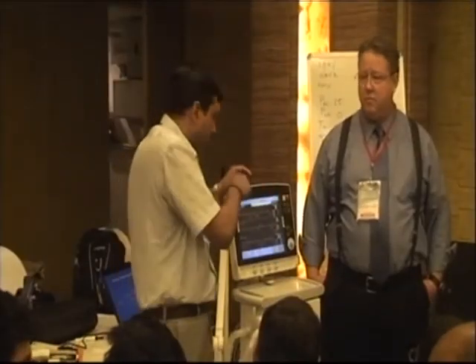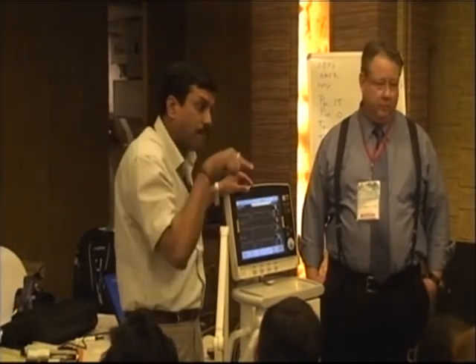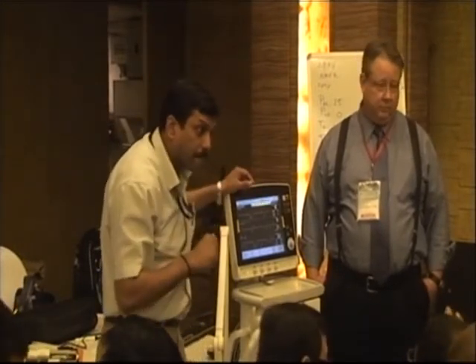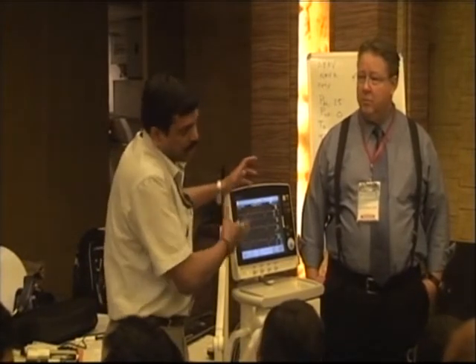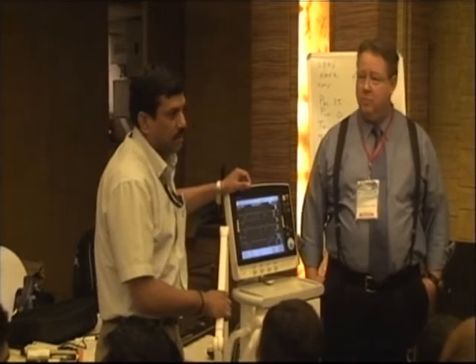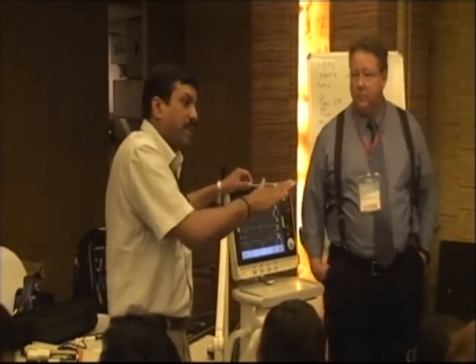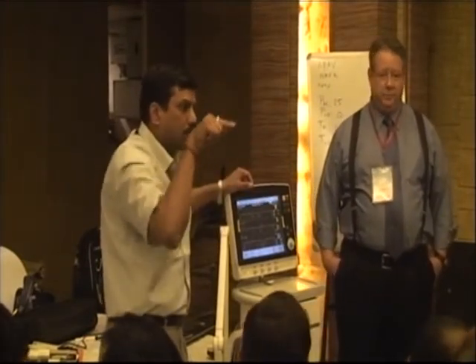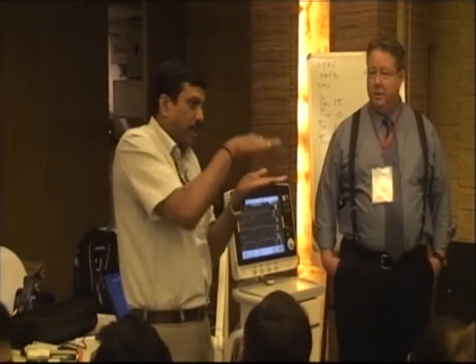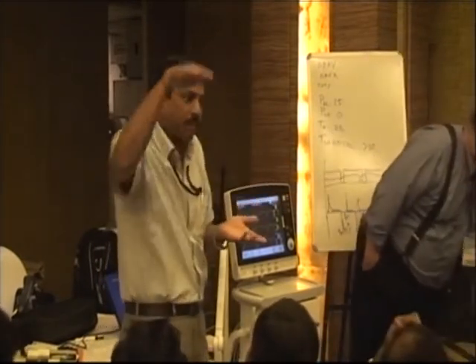But in this mode, the patient can breathe on both the CPAP levels, so it doesn't go back to the baseline. The ventilator has this specified mode. You can do the same thing in pressure control ventilation with inverse ratio, but there, if the patient triggers and you go to the baseline, it will start a new breath. We don't want that. We don't want that de-recruitment to happen. In this mode, the patient can breathe on both the CPAP levels.